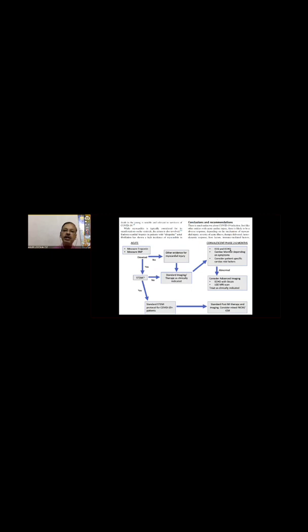But overall, the first impression is that you have to have the average global longitudinal strain. If it is less than 20%, then I first look at the bullseye, and if you are not sure from the bullseye which particular segment is maximally affected, I told you about Fabry's disease. In a lot of patients, amyloidosis and Fabry disease look similar in echocardiography, and you may not be able to differentiate them. But if you see that the posterior inferior segment is particularly affected, then you can give a clinched diagnosis that it could be Fabry's disease, and then go ahead with the cardiac biopsy. So these are the areas.